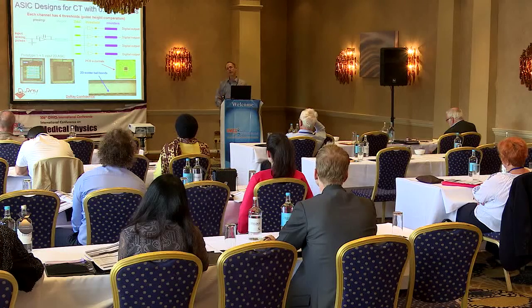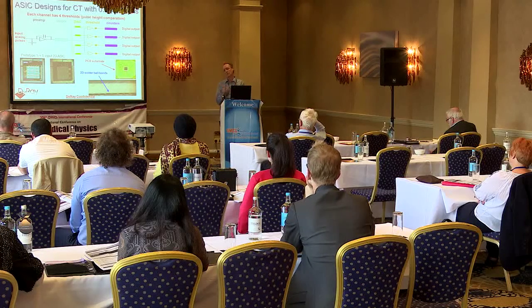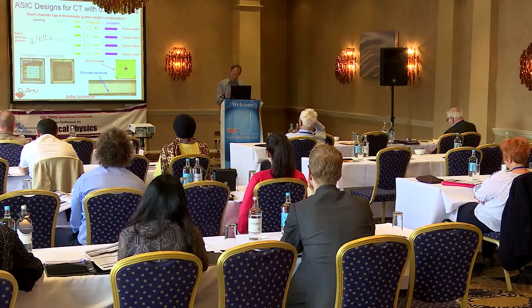With 4 different energy bins, we can target new applications, such as the K-edge imaging of nanoparticle contrast agents, such as gadolinium, bismuth or gold nanoparticles. And these nanoparticles are being developed which have function. And if we can then image the nanoparticles by doing K-edge imaging, then it's going to be possible to achieve functional CT for the first time.